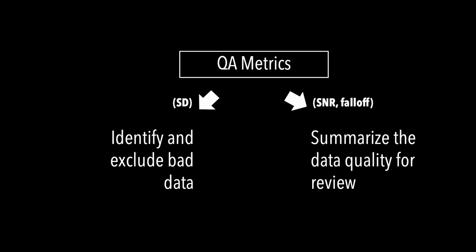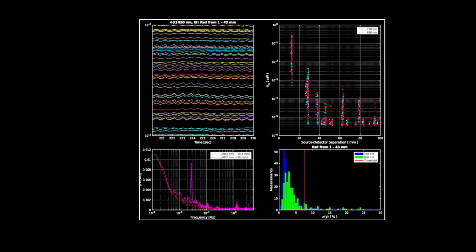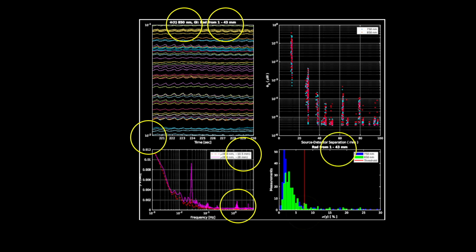Additionally, the QA code includes a number of parameters that tune the algorithm performance. Default values of these parameters are used in the tutorial and generally work well for a typical high-density optical array. However, these parameters may need to be adjusted when working with some types of data. As always, you may contact the NeuroDOT development team for help in customizing the software for your specific application.